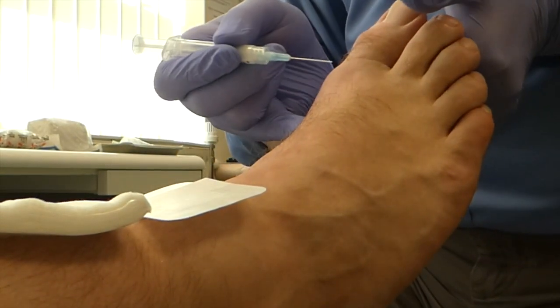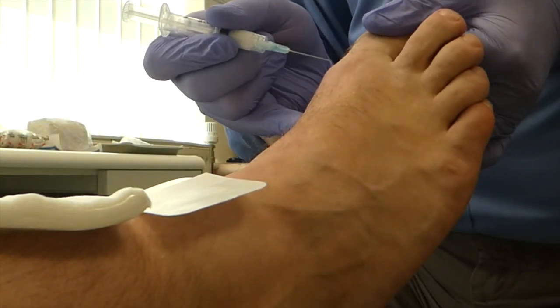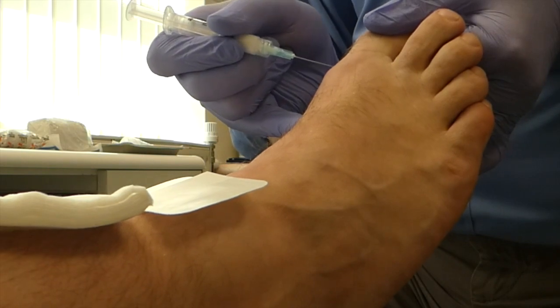So the technique is: there's the joint line — I can see it better than you can. Gently distract, plantar flex. Tendons there. Going in dorso-medial. 3, 2, 1 — scratch, Nick.